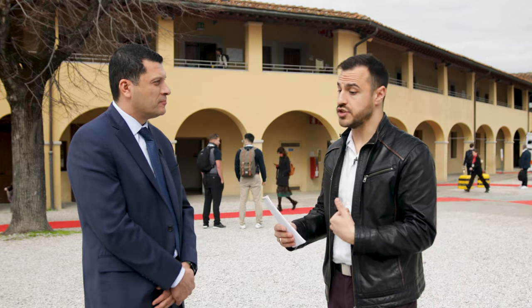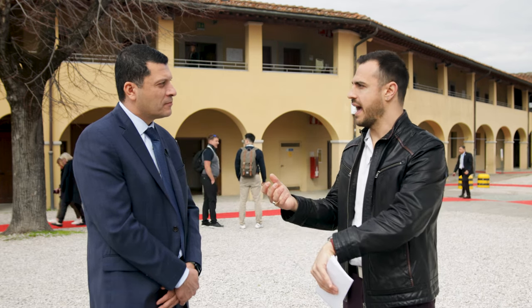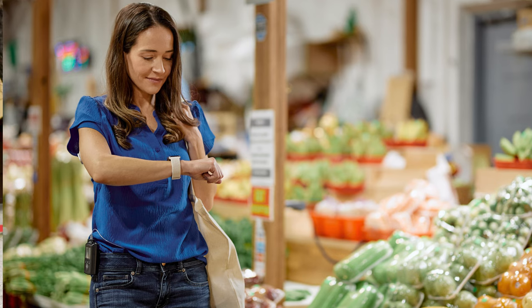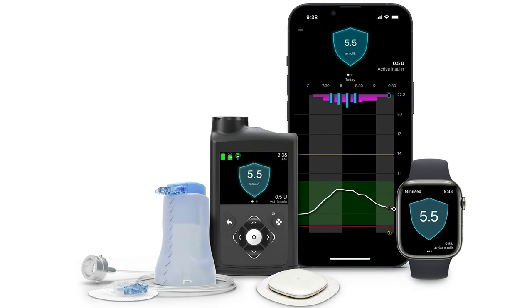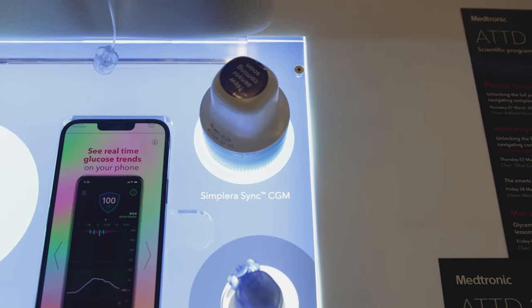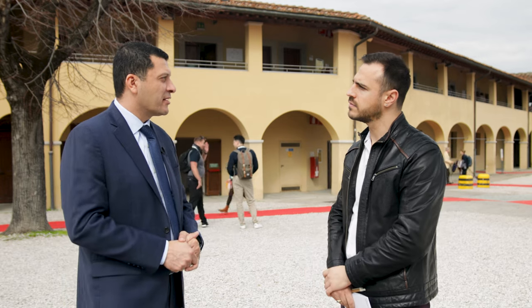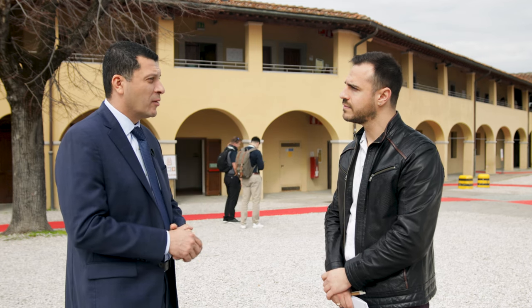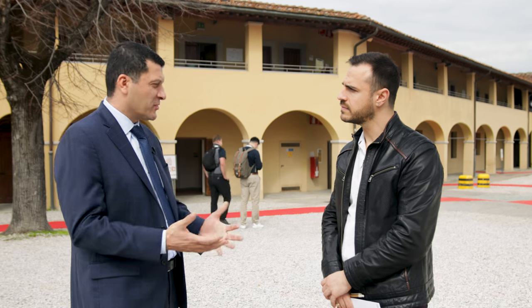The 780G app carries all the information from the pump — CGM graphs, time in range, active insulin, previous history, alarms and alerts, cloud connectivity, and care partner data sharing. On the Apple Watch, you can see your current glucose and tap again to see the glucose graph.